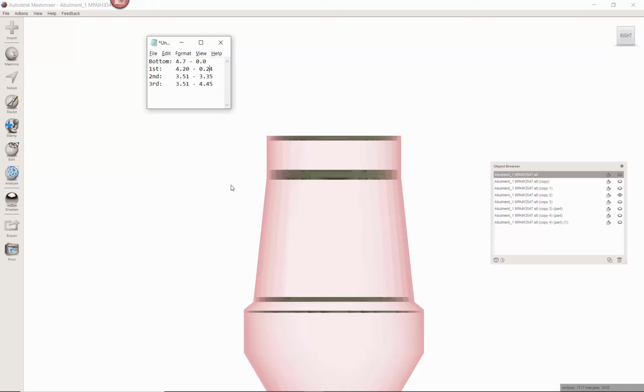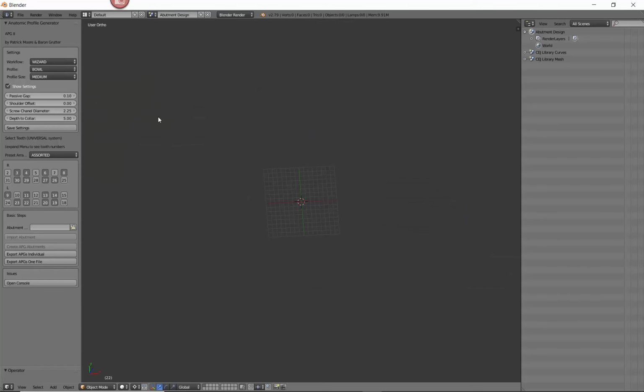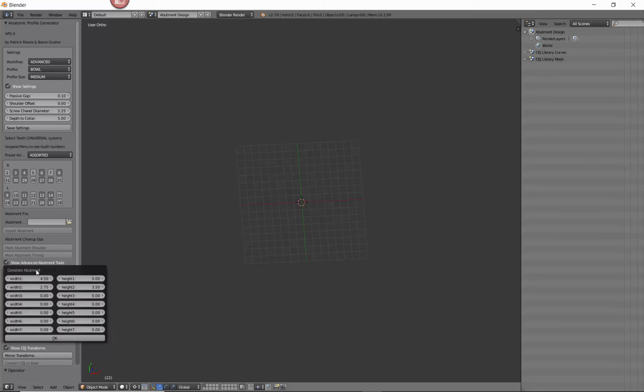So these are the measurements I've created. So now I'm going to go into Blender, the APG2 software, and show you how to use it. What I need to do is create the abutment. So to do that, I need to change my workflow to advanced. Click right here. Now I'm going to come right down here where it says Show Advanced Abutment Tools. I'm going to click on that. And then this button right here is Create Abutment from Measurements.